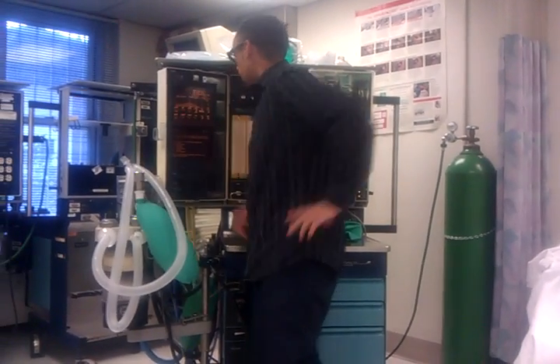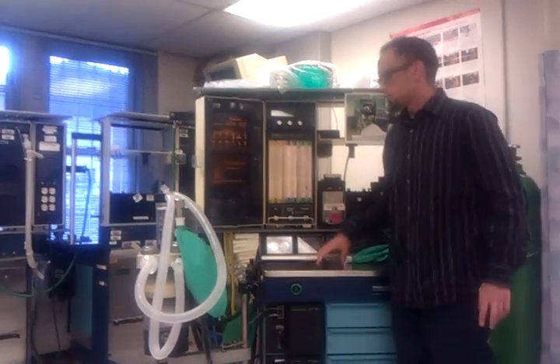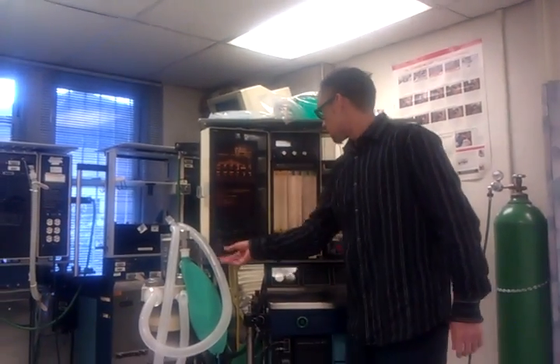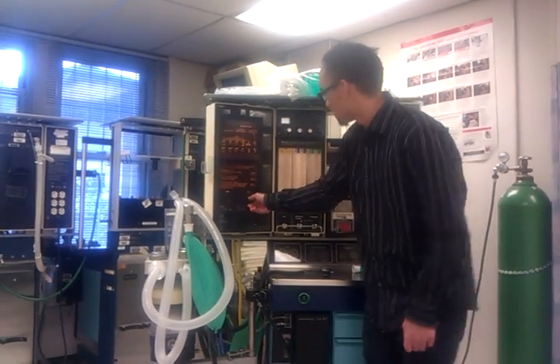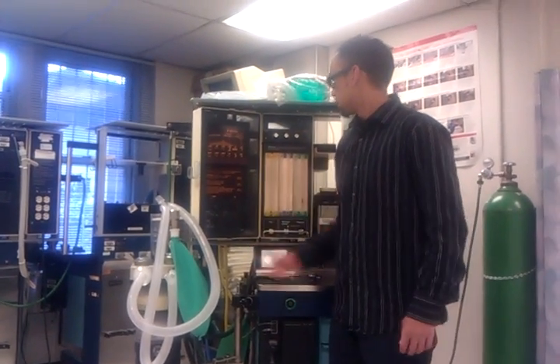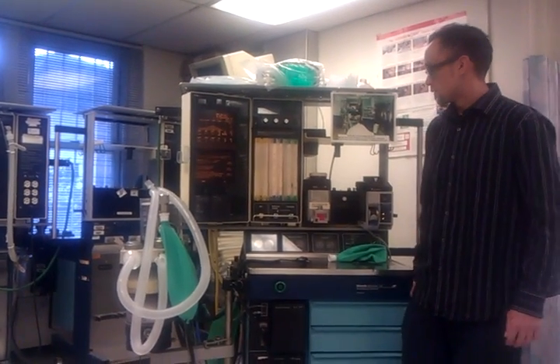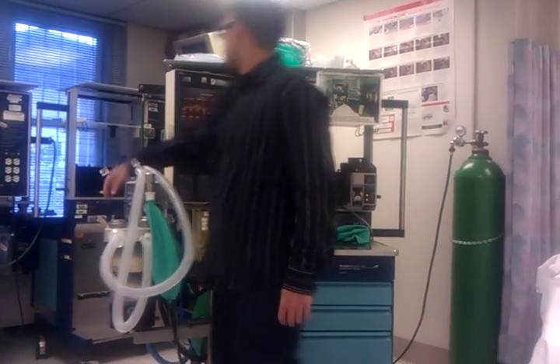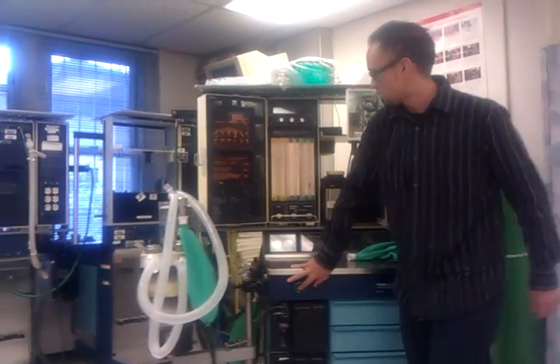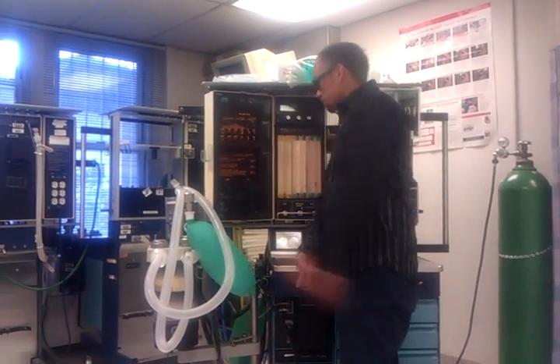I'm going to check my O2 sensor. I'll expose it to room air and calibrate it to 21%, because that's how much oxygen is in room air. It's at 21%, so it detects room air well. I'll put it back inside the oxygen sensor port, hit fresh gas, and I want it to read above 90% — which it does, reading 90%. So my sensor checks out.